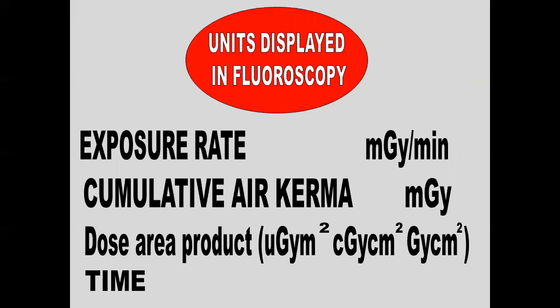So the circumference of your patient's hard to control, especially at the VA. If you go into practice and you can work on little old ladies the most, that's going to reduce your radiation the most, if you can be selective.